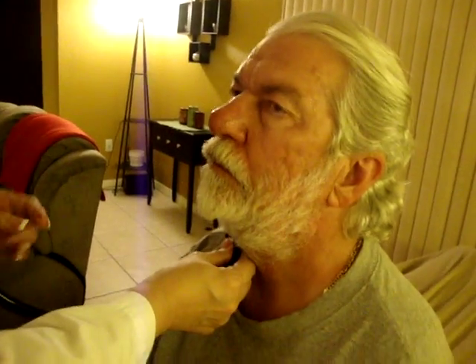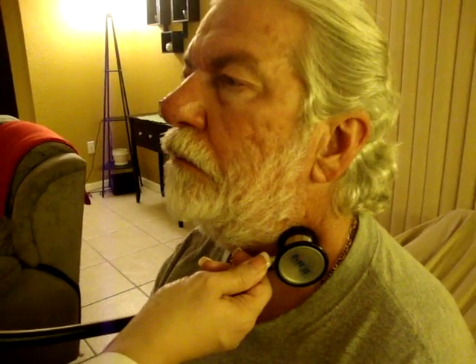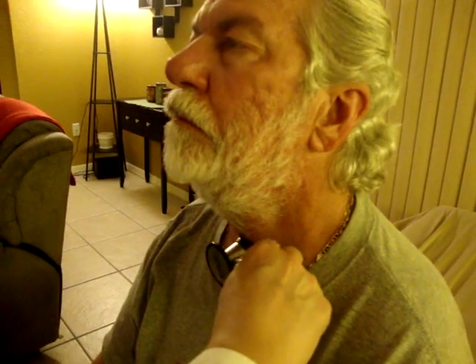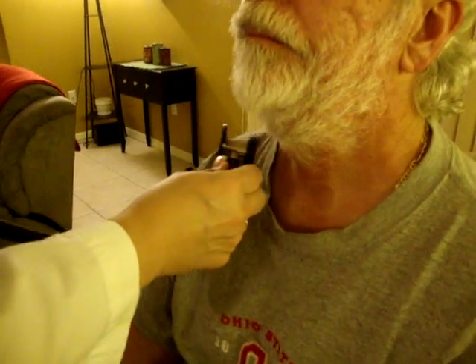Now I'm going to listen. Okay. One side at a time. Deep breath in and hold. Okay. And breathe out. Take a deep breath in and hold. Checking for the thyroid. Okay. Let it out. I'm going to take one more deep breath in and hold. And let it out. Great.